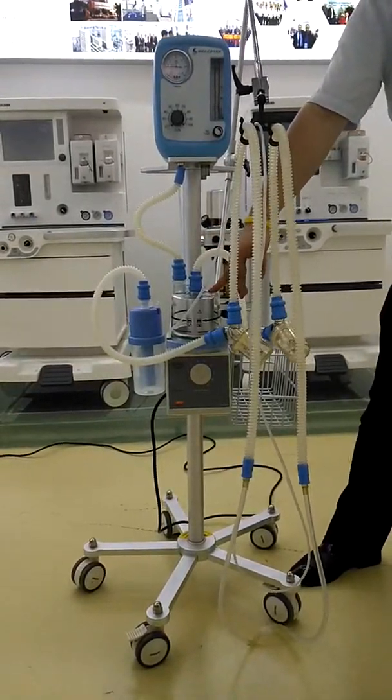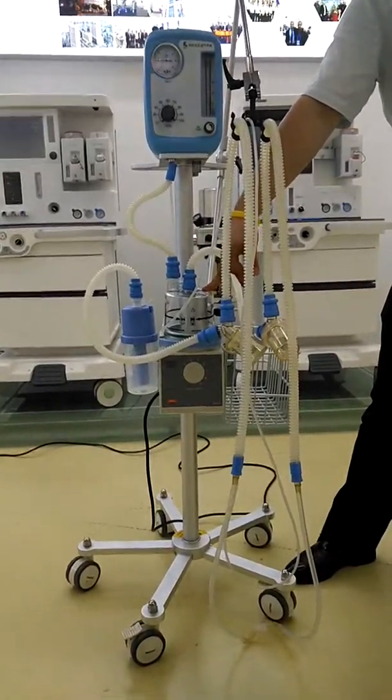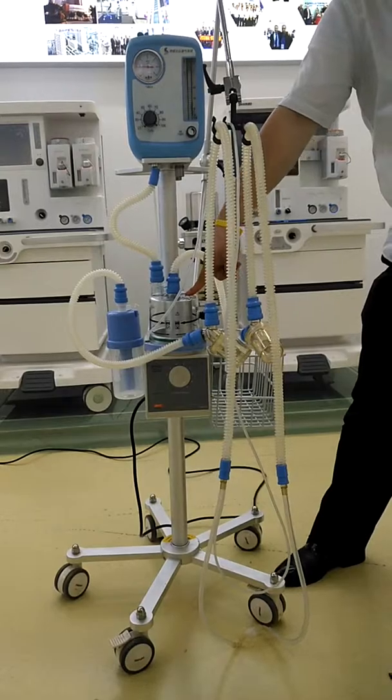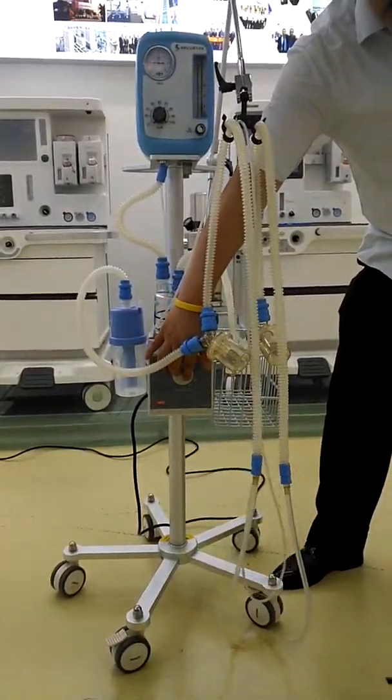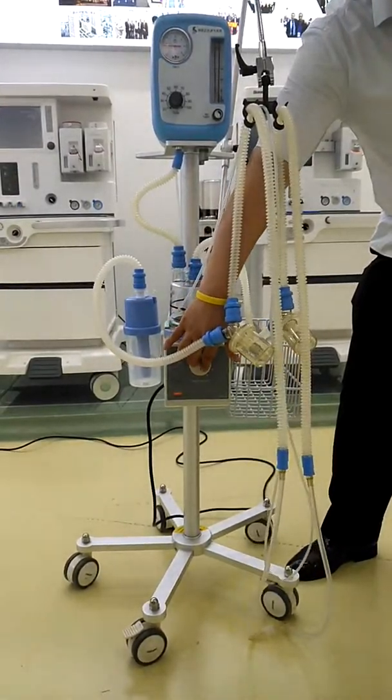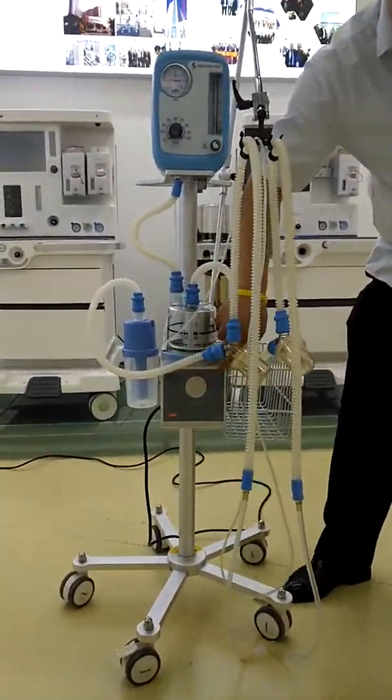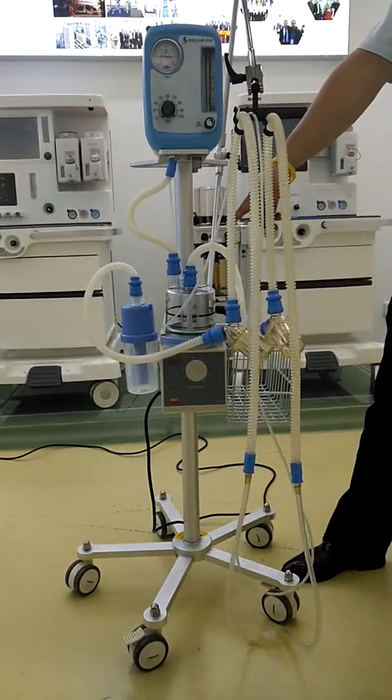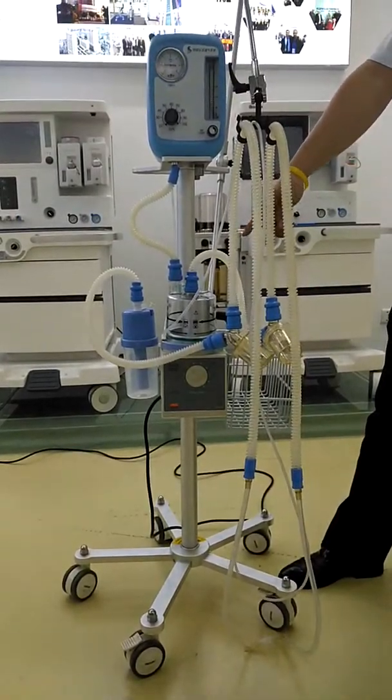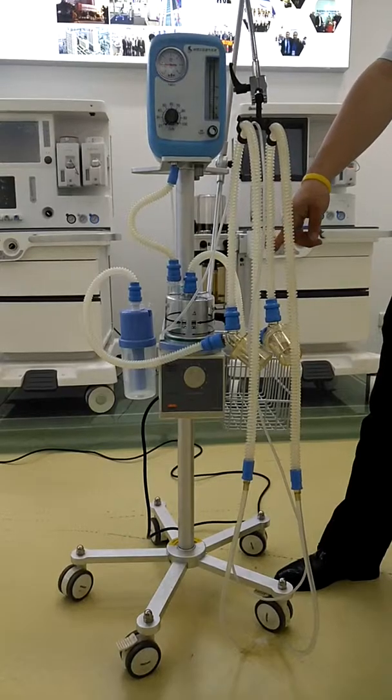This is the humidifier. We have three types and here we're using the basic one. You can adjust the temperature by rotating this button. We have different levels, and usually we need to check on the thermometer. If the temperature is around 35 degrees, we can stop adjusting.